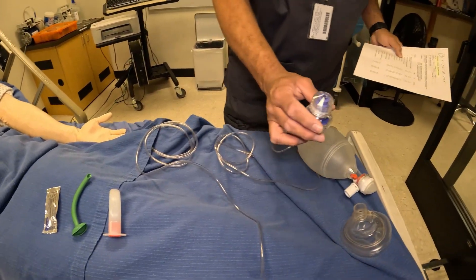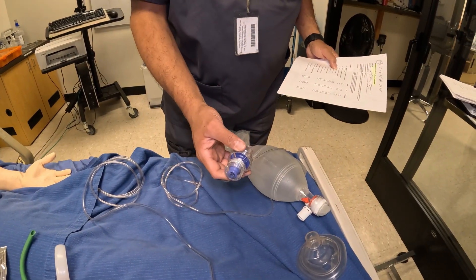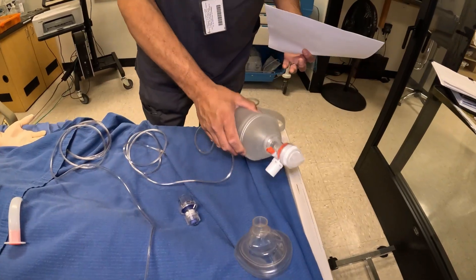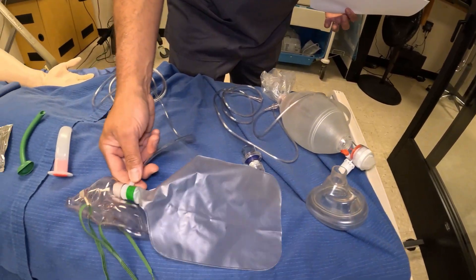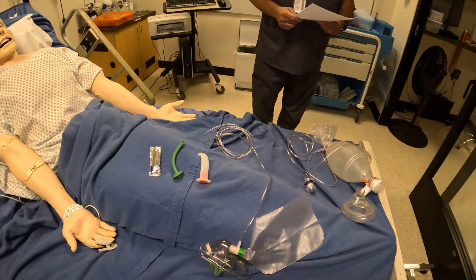We have what's called a PEEP valve. I recommend a PEEP valve be used whenever using the Ambu bag. We have the mask for the Ambu bag, the actual Ambu bag with the oxygen tubing, and then a non-rebreather with the mask, bag, and tubing. That's all of our equipment.